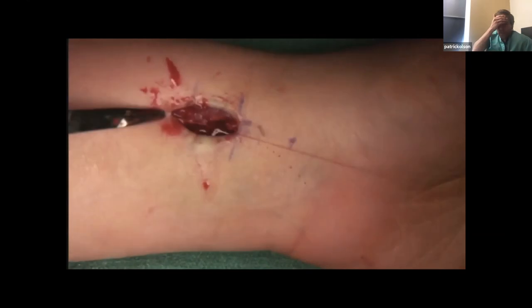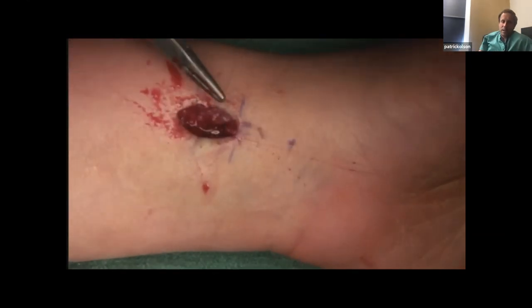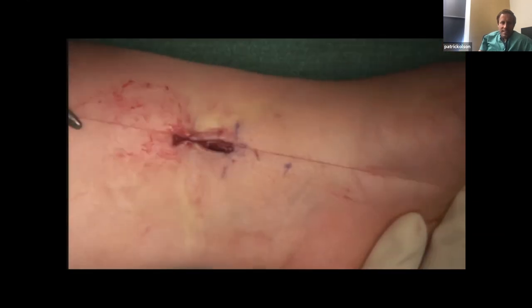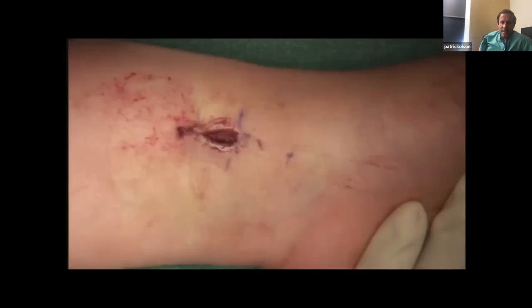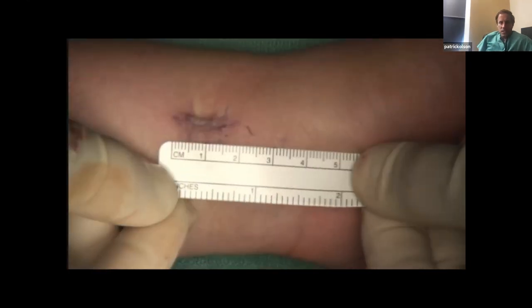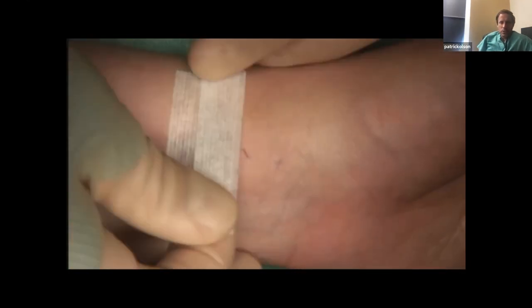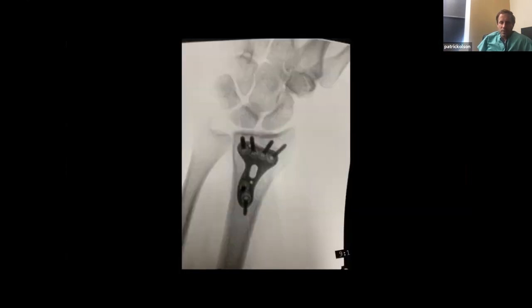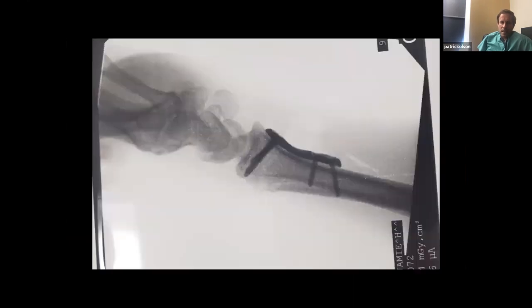This is arguable — I personally don't think there's a huge difference in keeping it intact, but I know Mark Ross thinks it does make a difference. I think if you have a good repair of the pronator quadratus, it doesn't make a big difference. There's the incision — it turns out about a centimeter and a half. I just use two Steri-Strips. Here are her post-fixation films — the AP view and lateral view. Just two screws, her alignment is anatomic, and she has a very small scar.